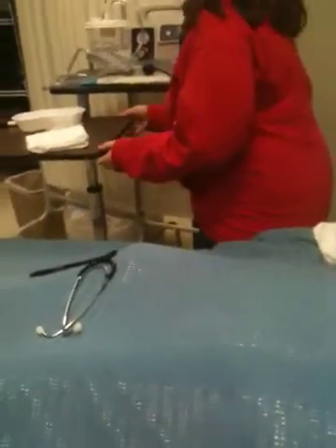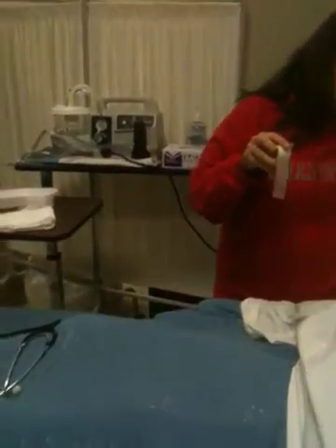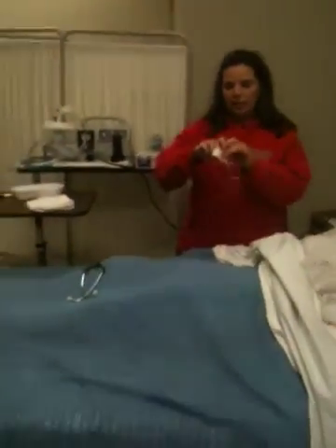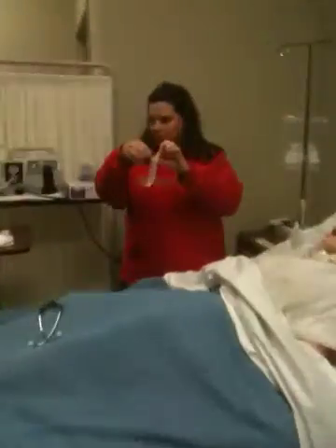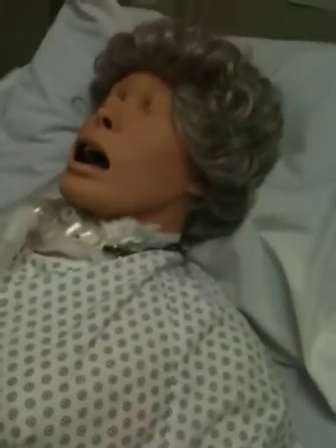I have my tape — I forgot to show you that as part of my supplies — I have two to three inch tape and I'm going to split the bottom. I'll tear off a piece and you'll see how I'm going to use this to secure my tube. Then I'm going to raise the bed to a comfortable working level, which is so important to save your back.